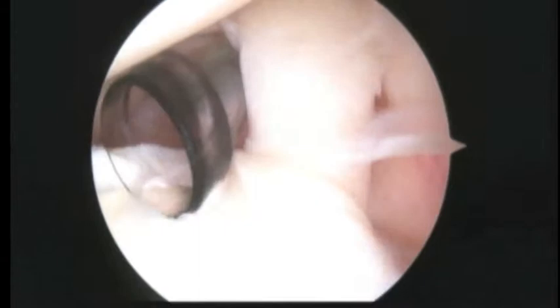I'm Dr. Buford, just getting started on the left shoulder, we're looking at it from the back to the front. Everything is magnified 30 or 40 times just like your other video. You can see here this biceps anchor is torn again. Because there's no extra-articular pathology, I think we can do a soft tissue tenodesis this time.